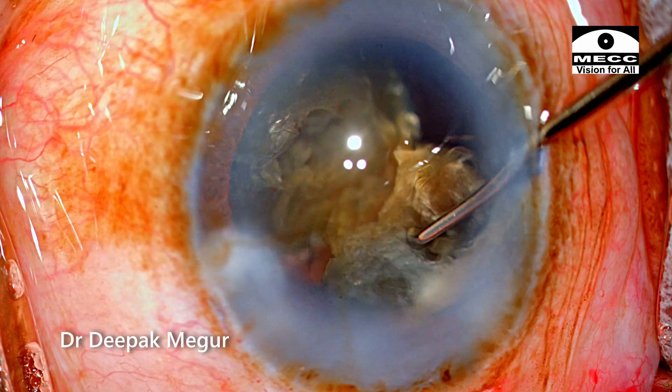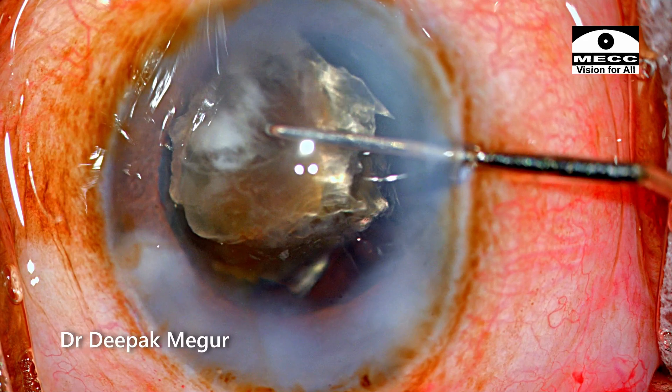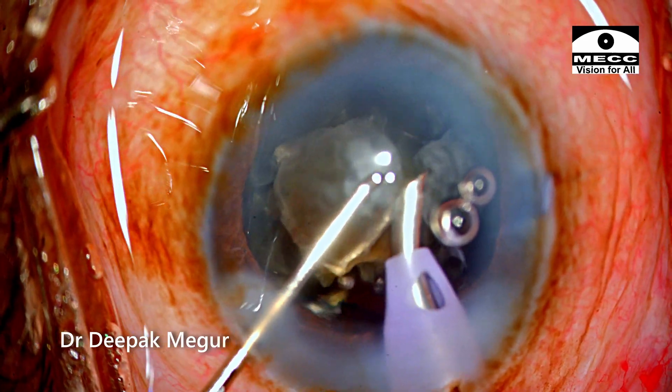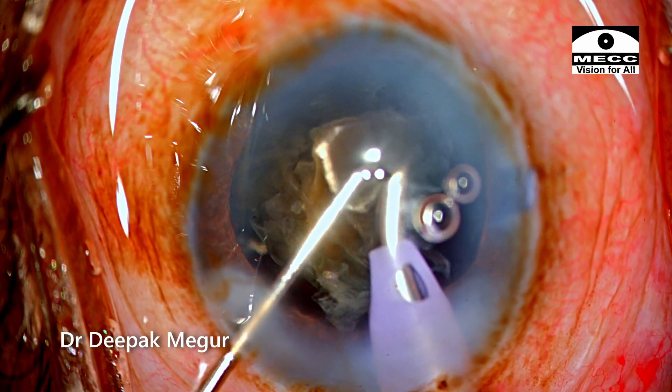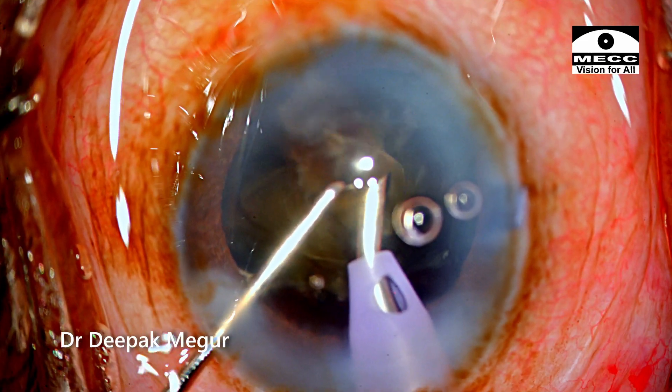This fragment has come out into the anterior chamber and is being manipulated back into the bag. Again, please note the position of the bevel as this fragment is being emulsified. The chatter has to be controlled via the foot pedal by using the right amount of energy.